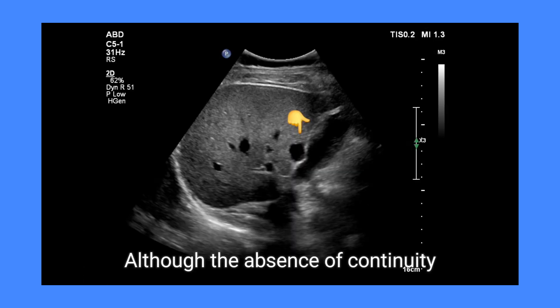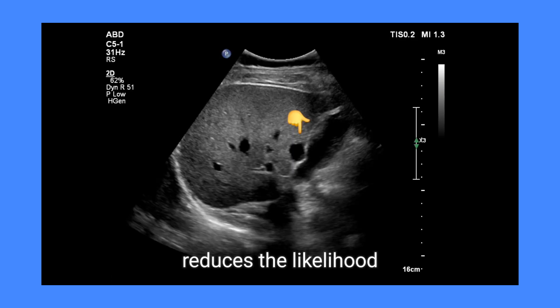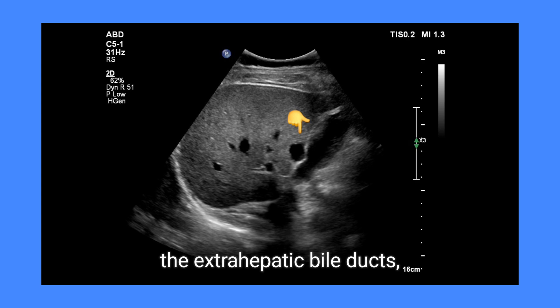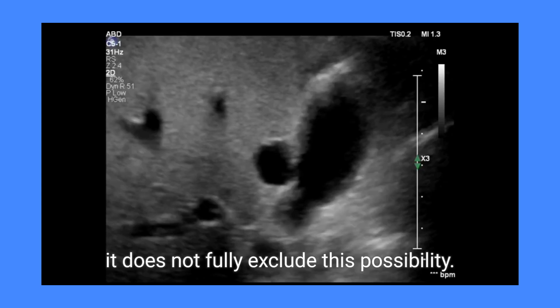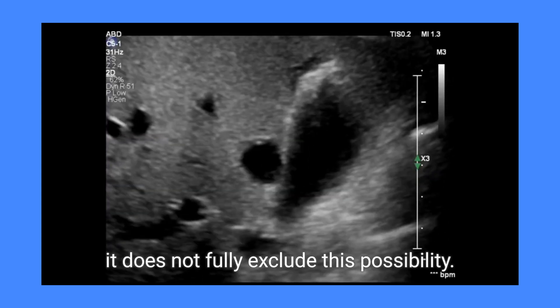Although the absence of continuity with the gallbladder lumen slightly reduces the likelihood of a choledochal cyst involving the extrahepatic bile ducts, it does not fully exclude this possibility.